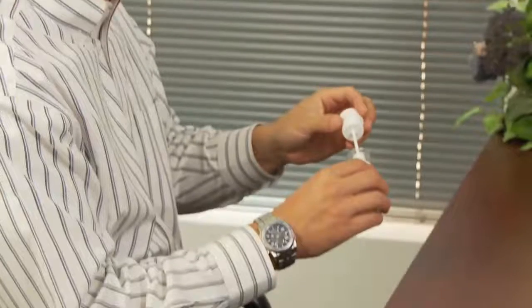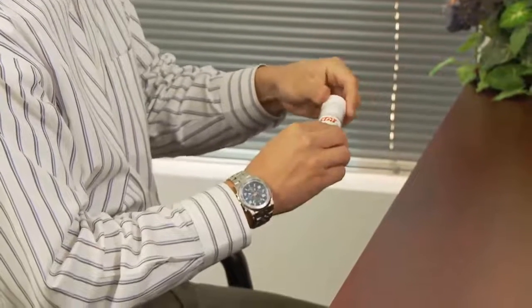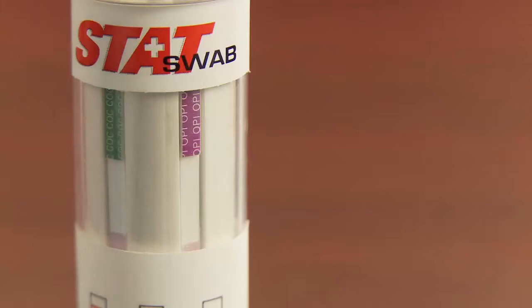When the swabbing is complete, ask the donor to insert the sponge into the collection chamber and screw on the collector cap until it is secure. Step 4. After the cap is in place, peel off the label to view the results. You should notice a pinkish color migrating or flowing up the test strips as the test begins to run.